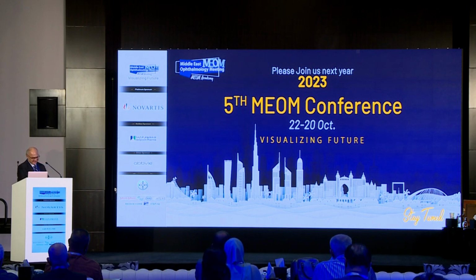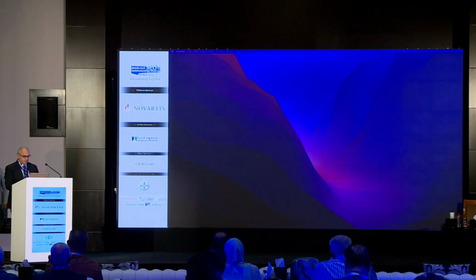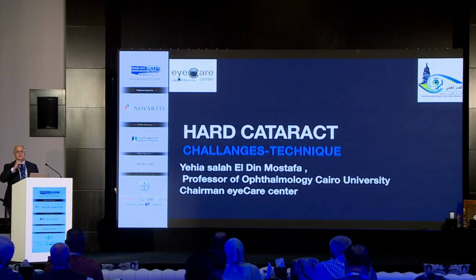He will present the 2 nuclei concept for the rock hard cataract.